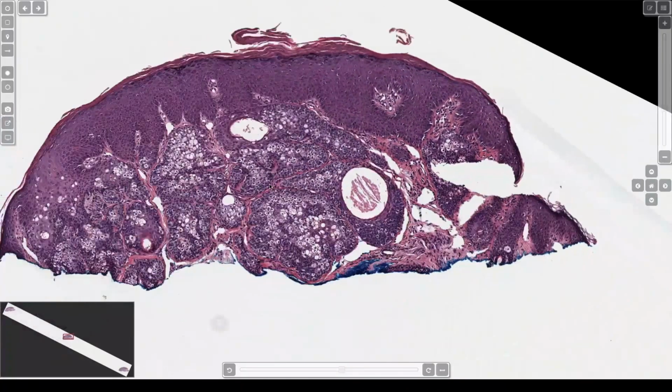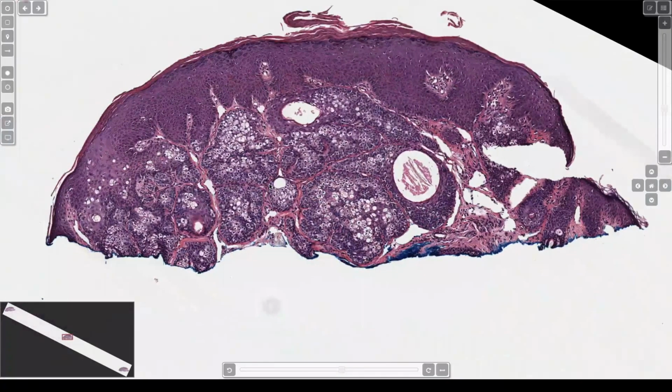And we usually in our practice include a comment in the report that sebaceous adenomas are sometimes associated with Muir-Torre syndrome, okay? What's Muir-Torre syndrome? Yeah, it's a mismatch repair. It's basically hereditary non-polyposis colorectal cancer syndrome with the addition of sebaceous tumors of the skin, okay? So sebaceous adenoma, sebaceoma, and some sebaceous carcinomas, when they're off the head and neck usually, can be associated with that. Sebaceous hyperplasia has no association.